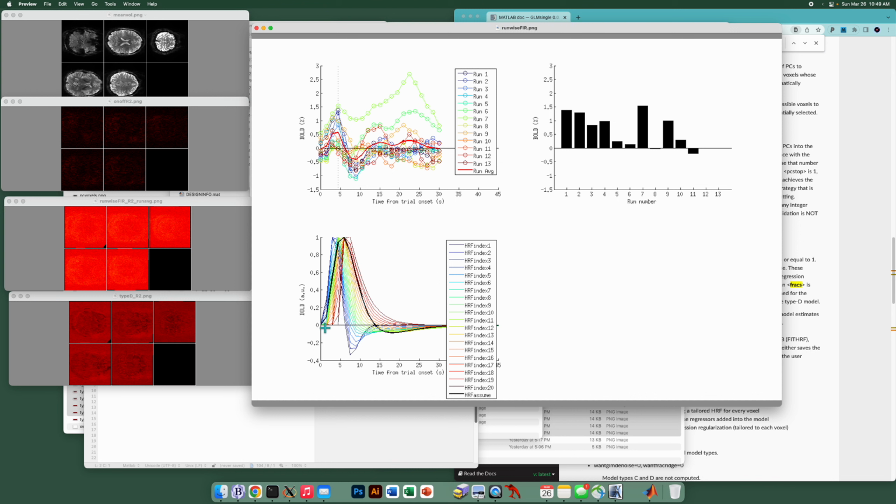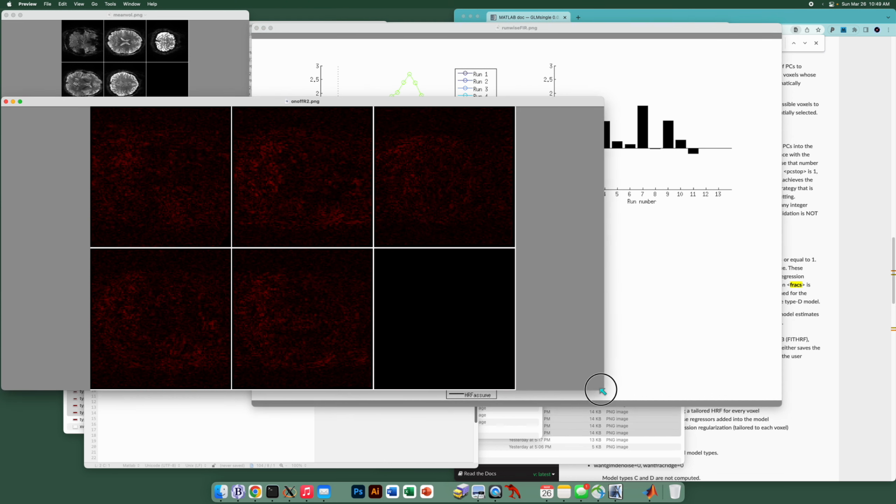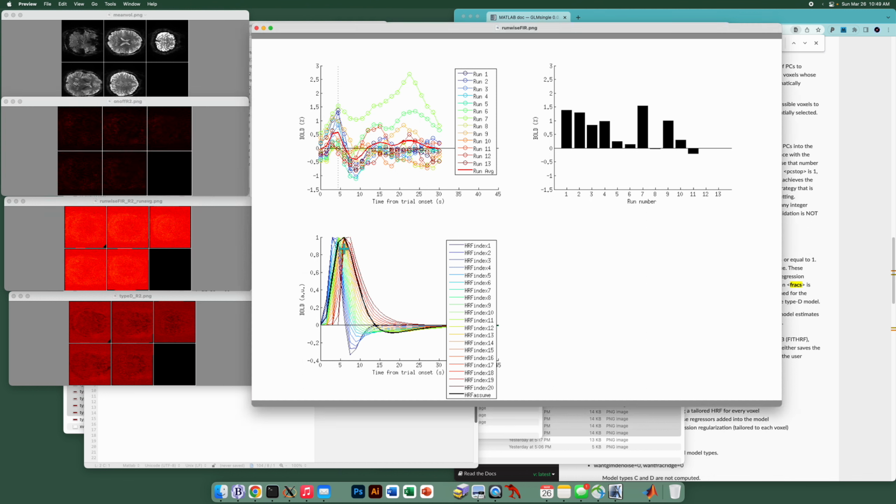And given that the canonical HRF, so that's actually something to stare at. So the black here is what the on-off model assumes. And the on-off R squared values are very bad. And if you visually compare this, notice the general peak in the empirically observed time courses is roughly here, and you compare that to what the black time course is, in some sense, it kind of mismodels it completely.